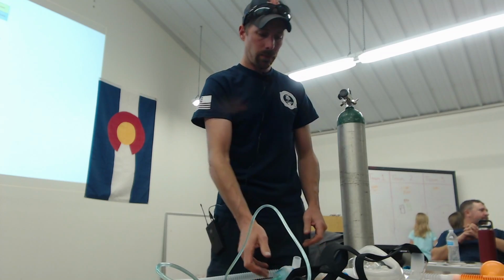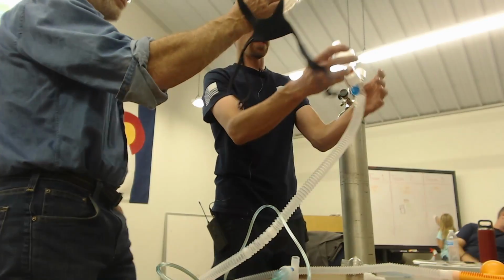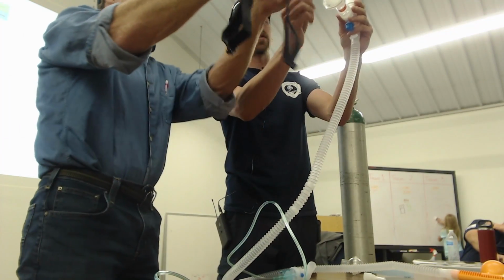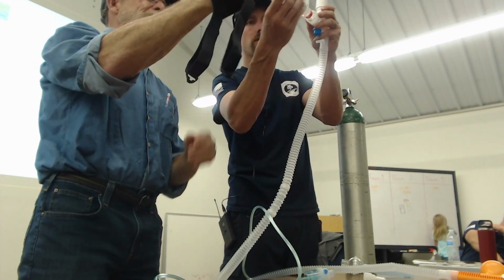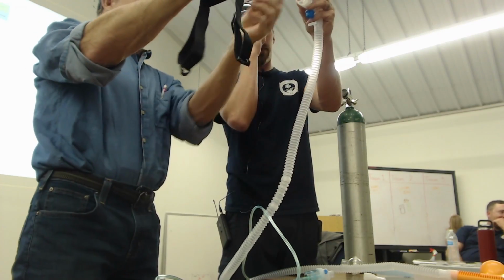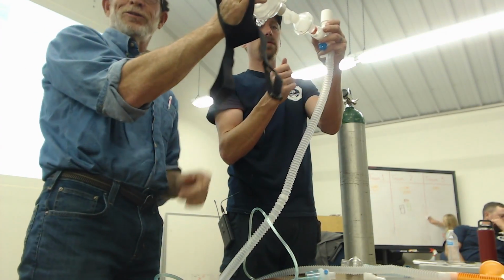Where would you put that in line in the whole sequence of events? As close to the patient as you can get it. Exactly. So on this side right there. So pretty much where this was, if this was a capnography adapter. So this would be the capnography adapter with the little wire coming out of it, but right next to the mask, essentially.